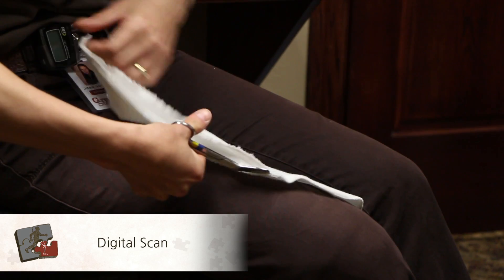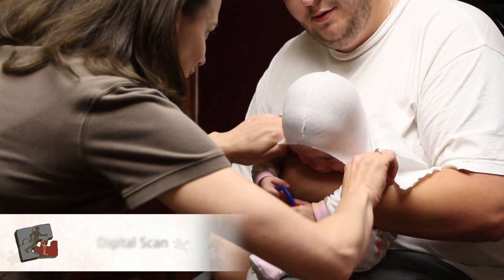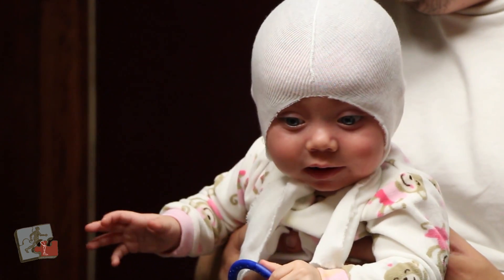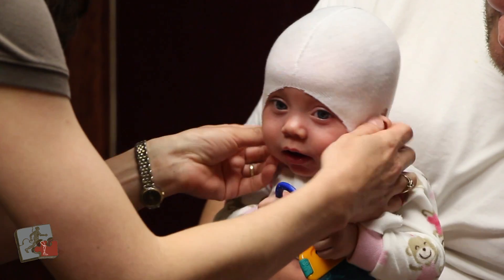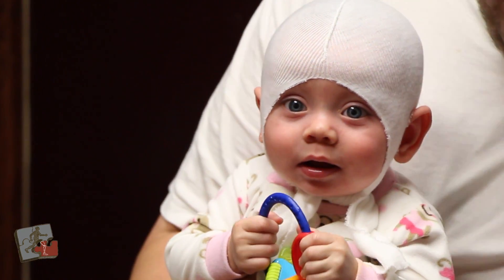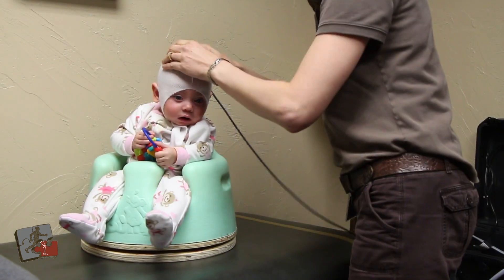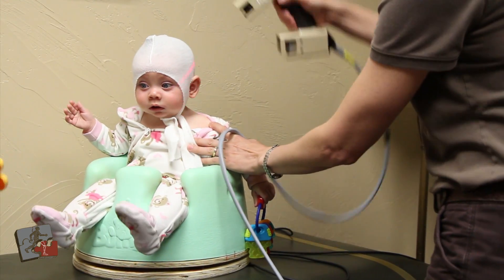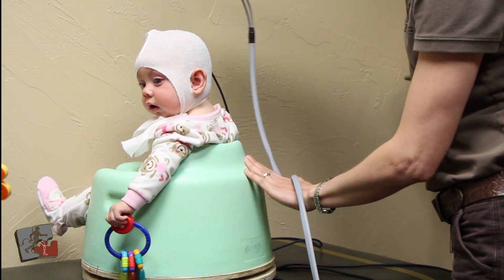Finally, we take a digital scan of the child's head with the Roden 4D Scanner CAD system. The scanning process is painless and only takes a few short minutes. We send these scans off electronically to make a custom cranial remolding orthosis.